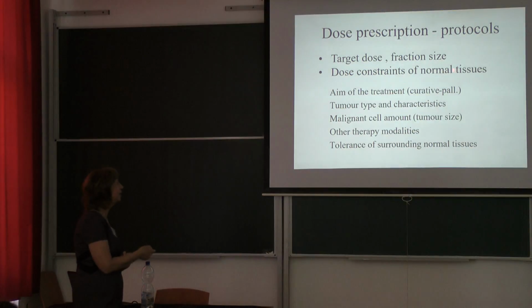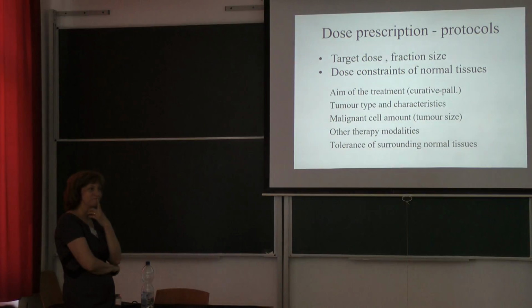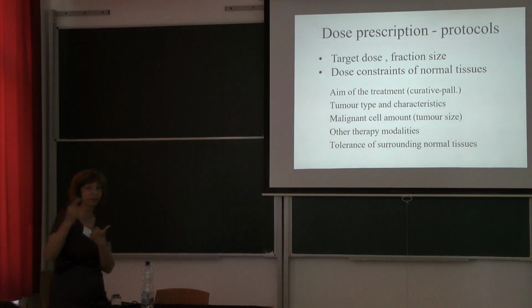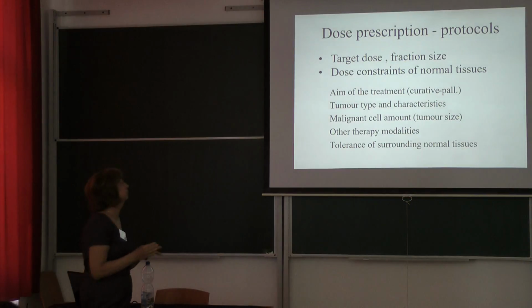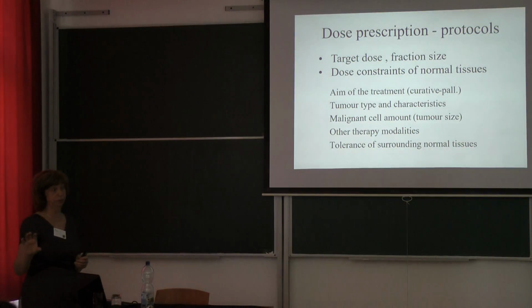But how I prescribe the... Isn't it WT, the waiting? No. I should give a lot of numbers. I can define the maximum dose, which should not be overstepped. I can give the mean dose, which I don't want to get higher, for example, for lung. And I can give for each little volume a certain number, a certain dose, which I don't want to have higher.